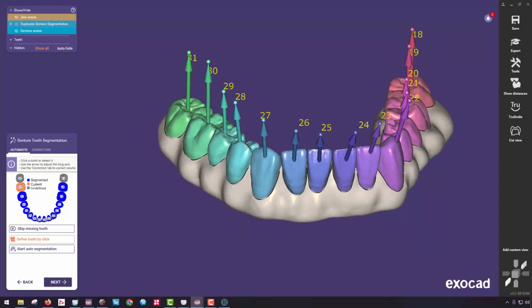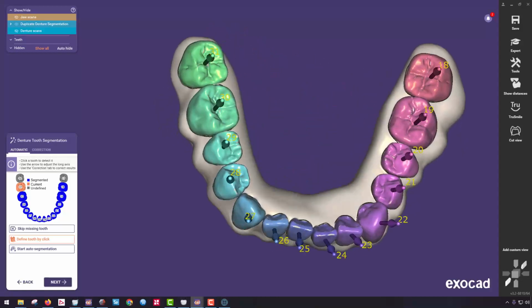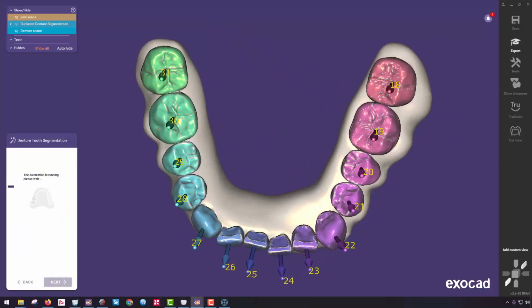Perfect. Now we want to make sure each one of these is labeled a number and a color to give us an idea of what we need to do. Then hit the next button. And the calculation will automatically go ahead and figure these things out for you. It makes it so easy, everybody.